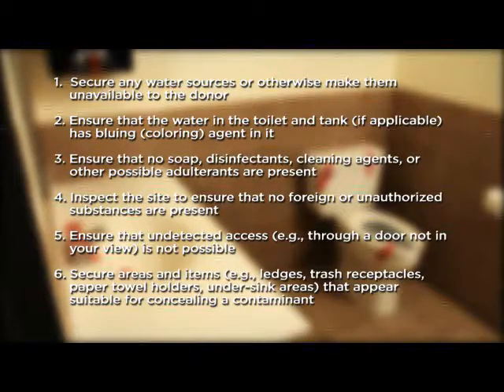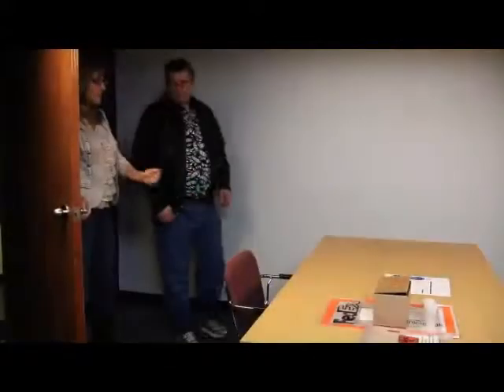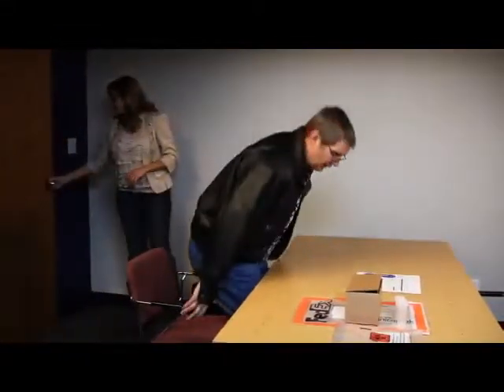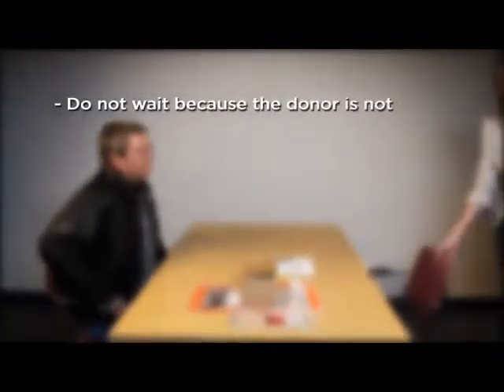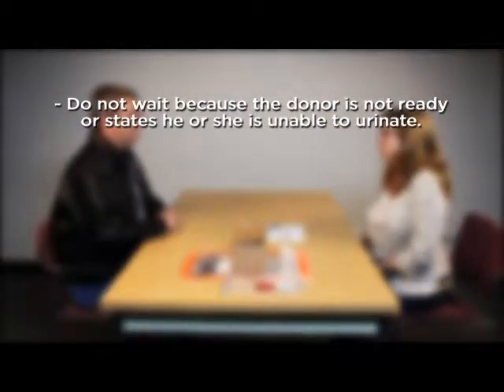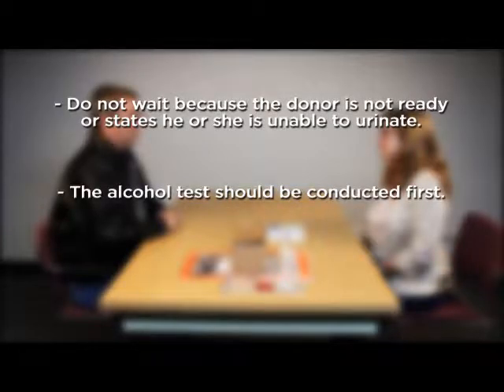Once the site is secured and all supplies are on hand, you are ready for the donor to present himself. The collection process should begin without delay once a donor arrives at the site. Do not wait because the donor is not ready or states he or she is unable to urinate. In most cases, donors who state they cannot provide a specimen will in fact provide sufficient quantity to complete the testing process. If an alcohol breath test is also scheduled, the alcohol test should be conducted first. Only one donor collection can be conducted at a time.